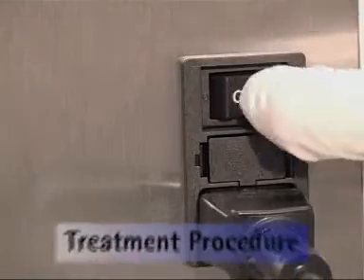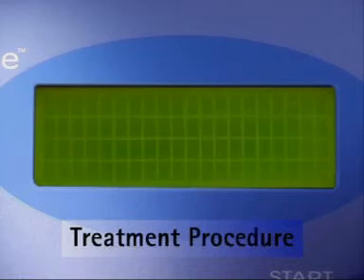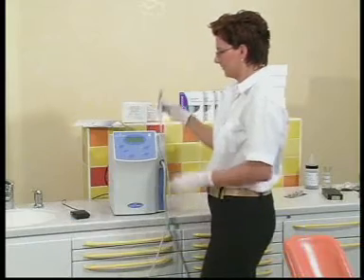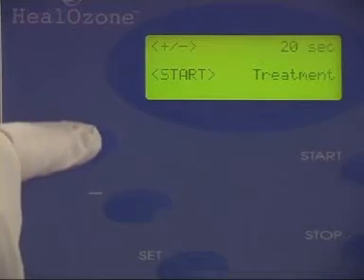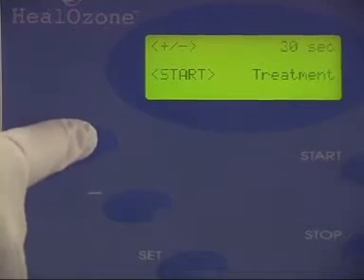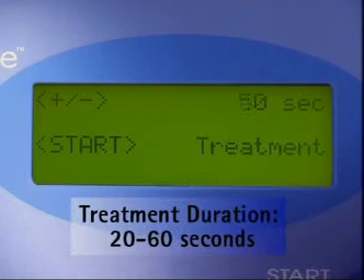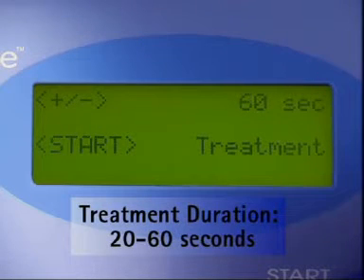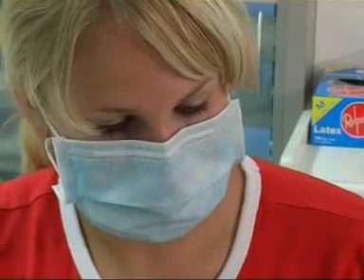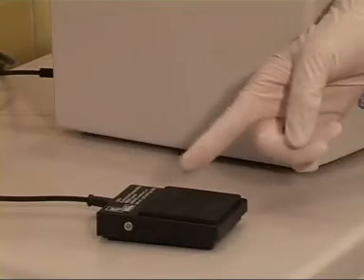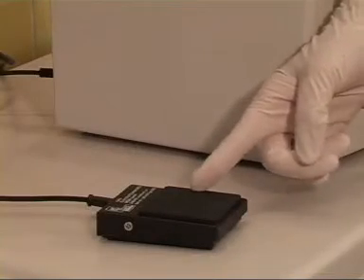When you turn on the unit, the start sequence appears on the display, followed by the main menu. You can now alter the treatment duration time with the plus or minus button. This duration time must be between 20 and 60 seconds. Now press the start button or the foot switch to begin treatment.